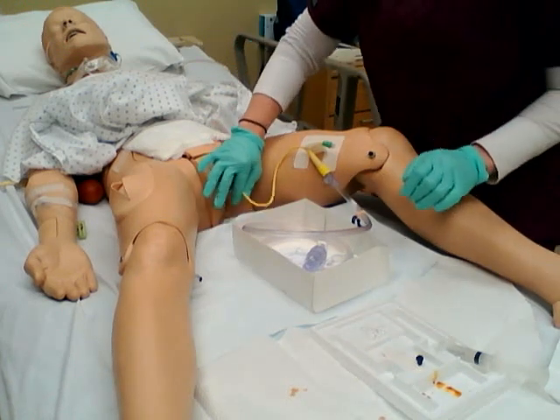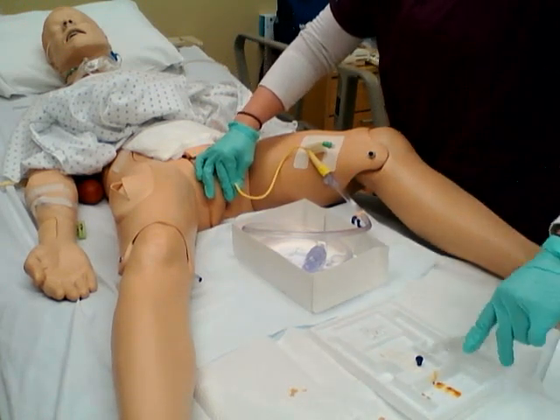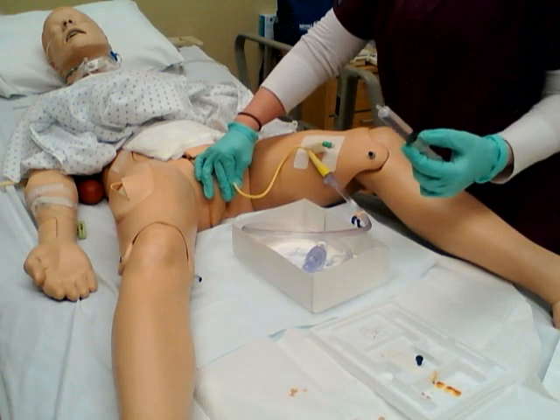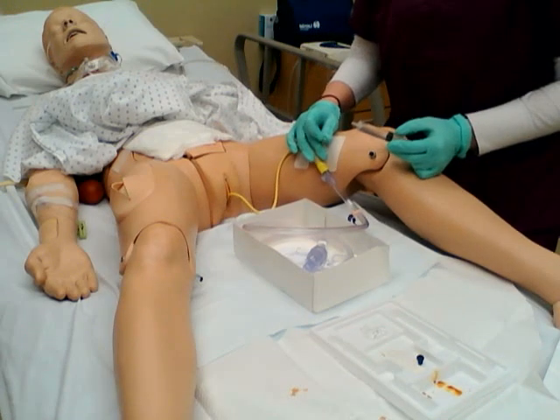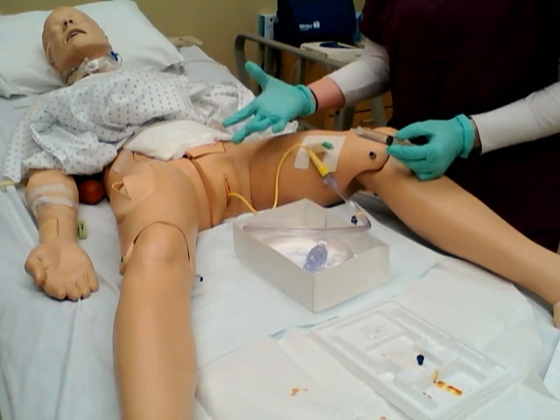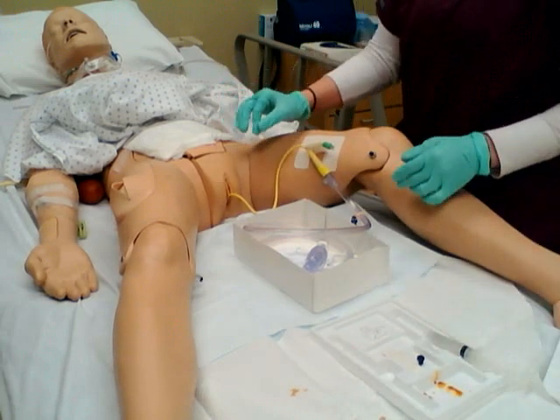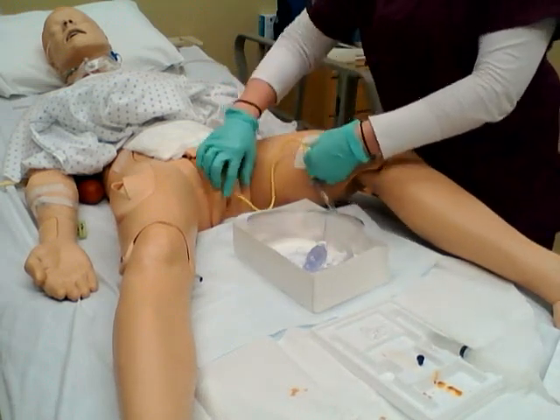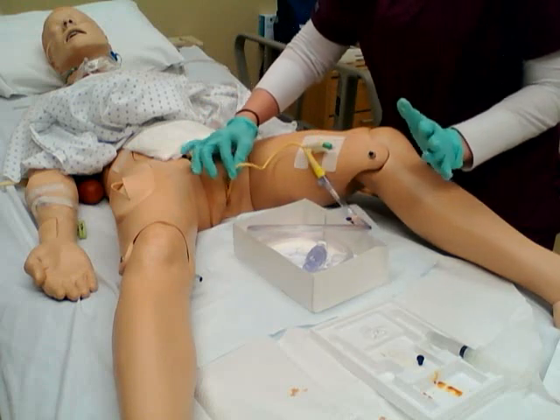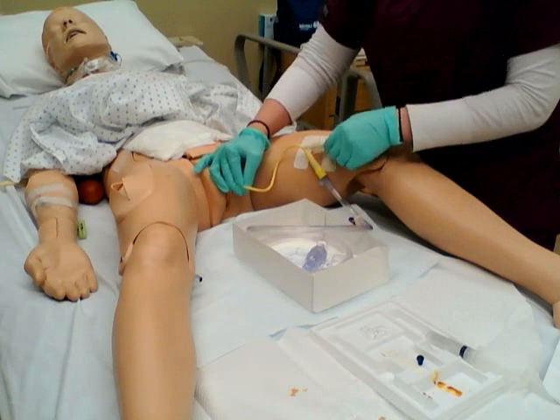So after I was done with that, I would keep this clamped because the urine is returning. Keep this clamped, and I would insert 5 milliliters of water into the tube so that the balloon is full, so the urine doesn't keep leaking out and the catheter stays in place. That would be done before I would attach this and before I would contaminate my hands at all. You got to keep that clamped and put that water in there.